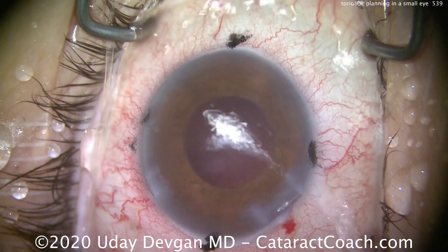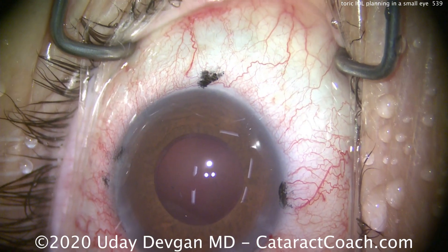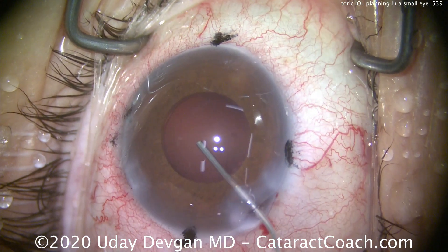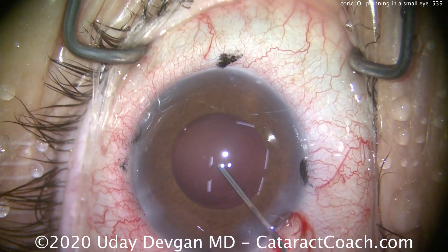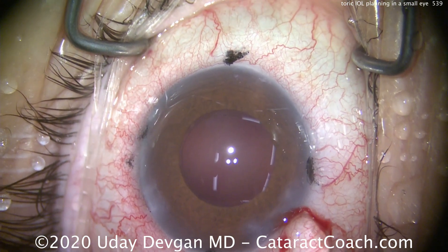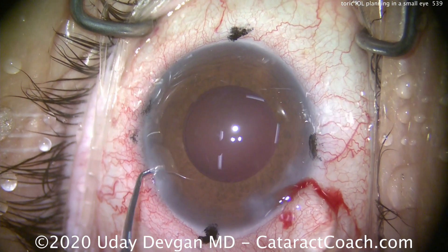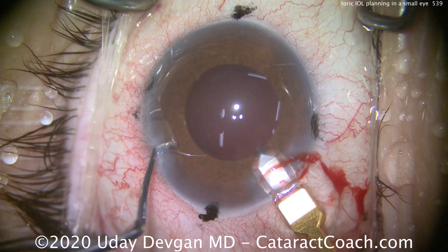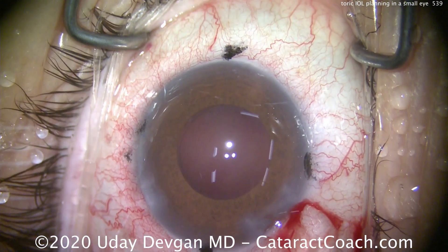Everything's cleaned up, the capsular bag looks great. Now it's time to load up the lens and fill the anterior chamber and capsular bag with cohesive viscoelastic — there's a good fill. The lens is going to be again for a highly hyperopic patient, so we'll first enlarge the incision. This requires a larger B cartridge, so we enlarge the incision to about 3 millimeters, which will also help with the astigmatism because it's on the steep axis.